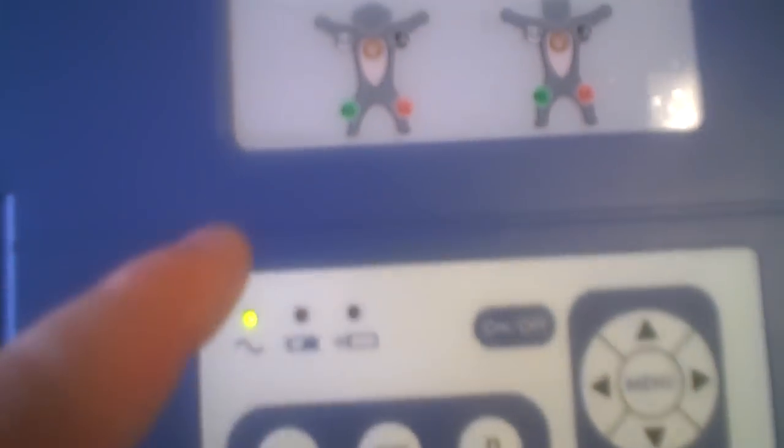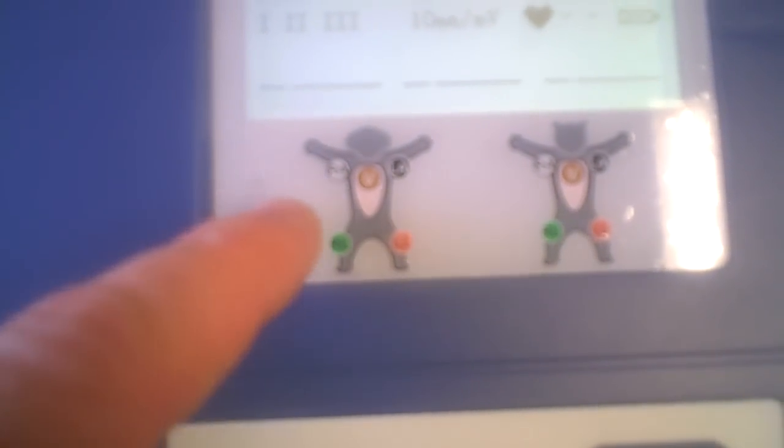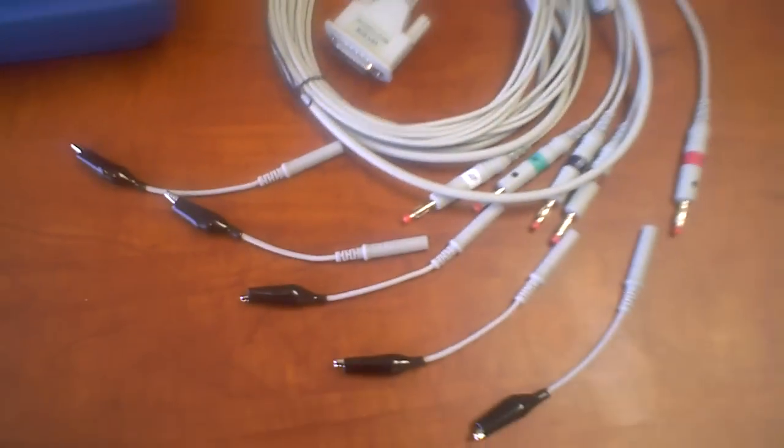If you look at the setup here, it only has five lead cables — one for each of the pit areas, and of course one right in the middle where the sternum is. Here are the lead cables that come with it.